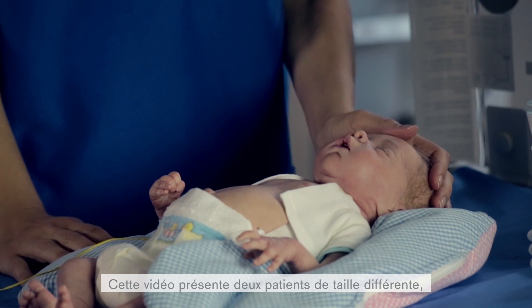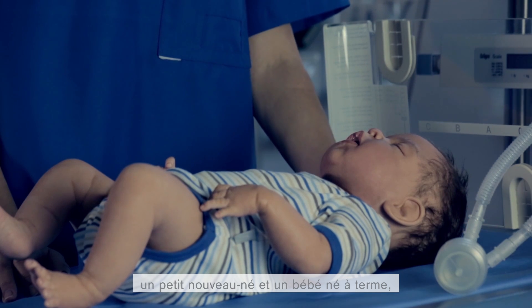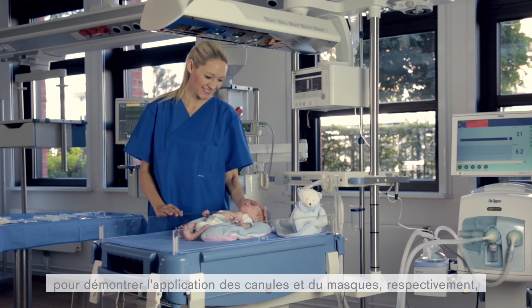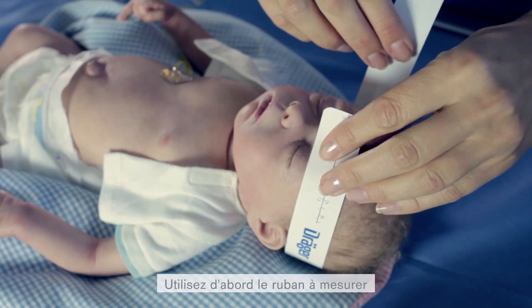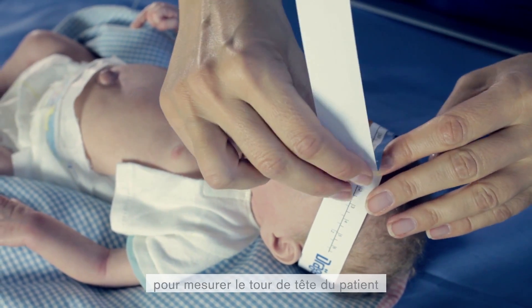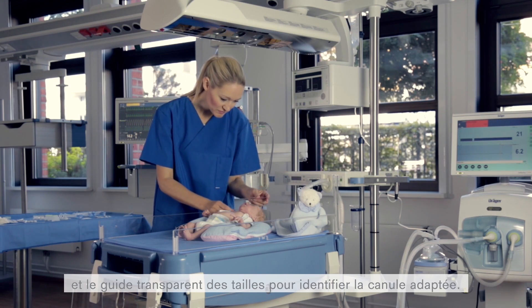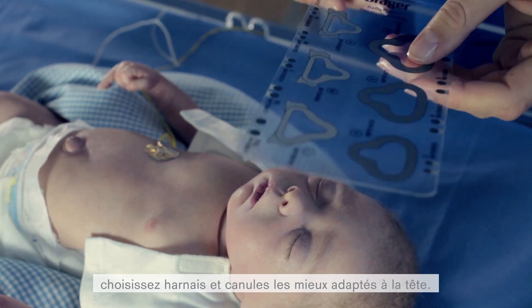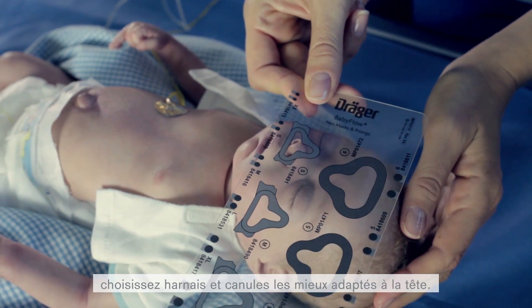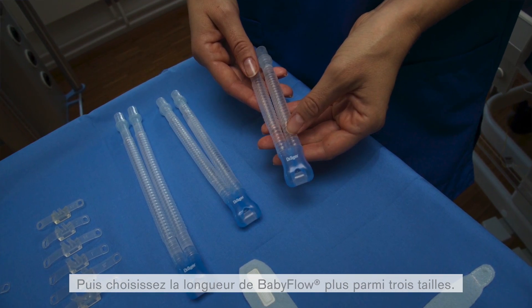In this video, we will show two different size patients — a neonate and a full-term infant — to demonstrate the application of the prongs and the mask, respectively, with the Baby Flow Plus. Start by using the measurement tape to check the head circumference of the patient and the sizing card to identify the appropriate prong size. Based on these measurements, choose the best fit headgear and prong option for the infant, then choose the best Baby Flow Plus length out of the three offerings.